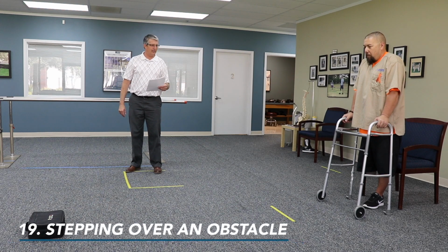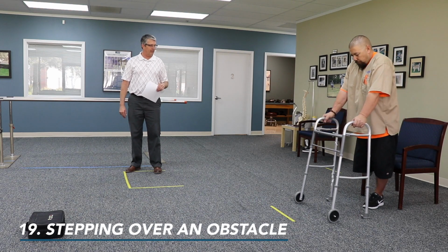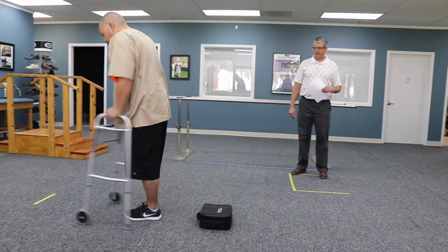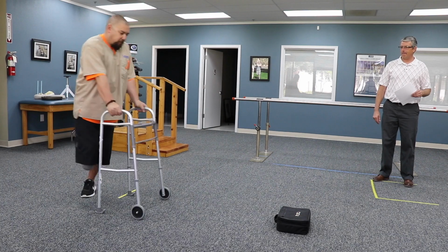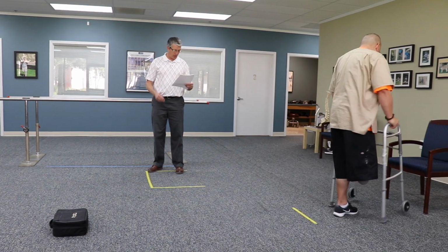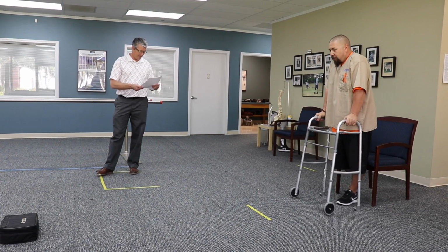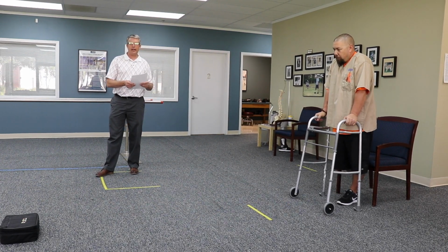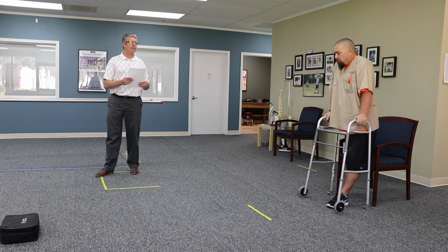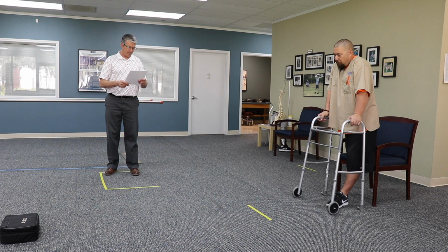Okay, number 19 is stepping over an obstacle. We're going to have Jay approach it without his prosthesis on, using an assistive device. Come back. All right, our superstar Jay was able to accomplish that pretty smoothly. Now, he would still get a 1 in that case because he didn't catch his foot, but he interrupted his stride. Makes sense. Doesn't have his prosthesis on. Okay, so he got a 1 on stepping over an obstacle.